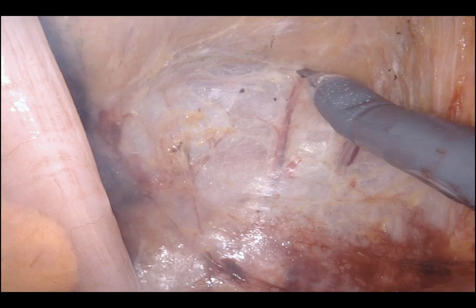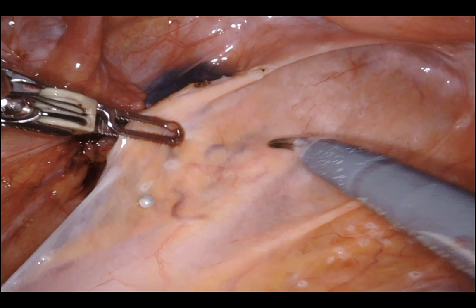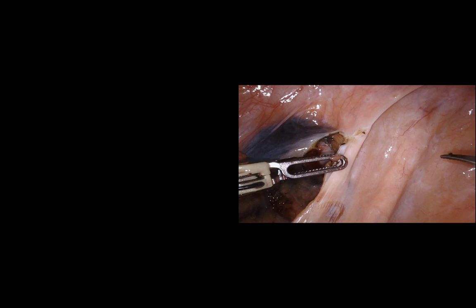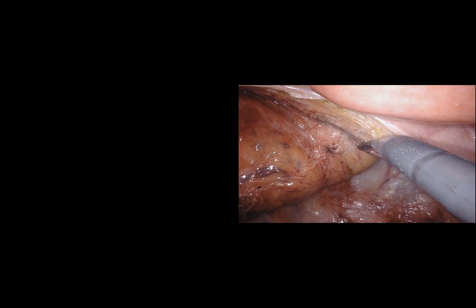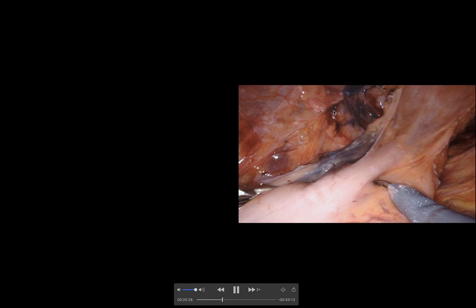Continuing the posterior meso-rectal dissection — always start dead center, work to the left, then to the right. You can see the pre-sacral venous plexus right there in the middle; do everything to avoid it. I went a little overboard on the meso-rectal dissection but I tend to do that even for diverticulitis — I like being able to straighten the rectum, which makes the EEA stapler much easier to bring up and gives fellows practice. Meanwhile setting up the colonoscope picture-in-picture to double-check the distal margin.